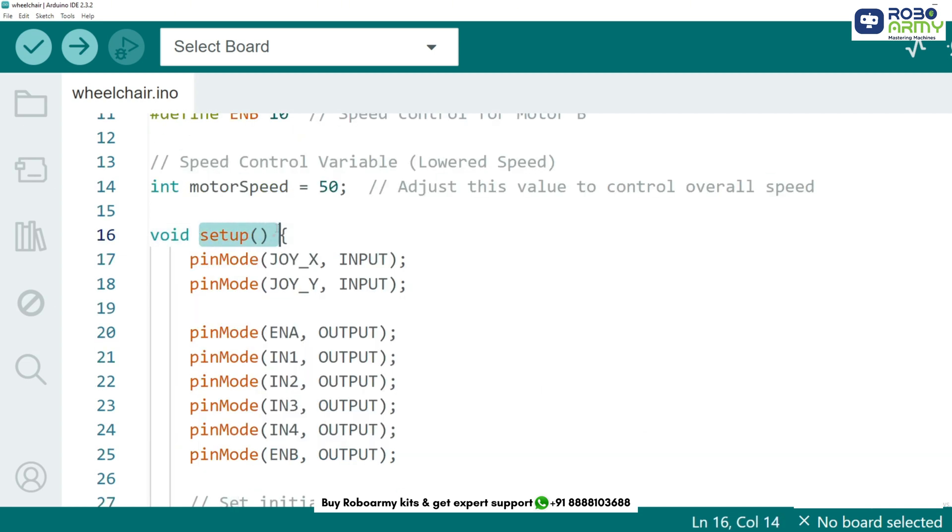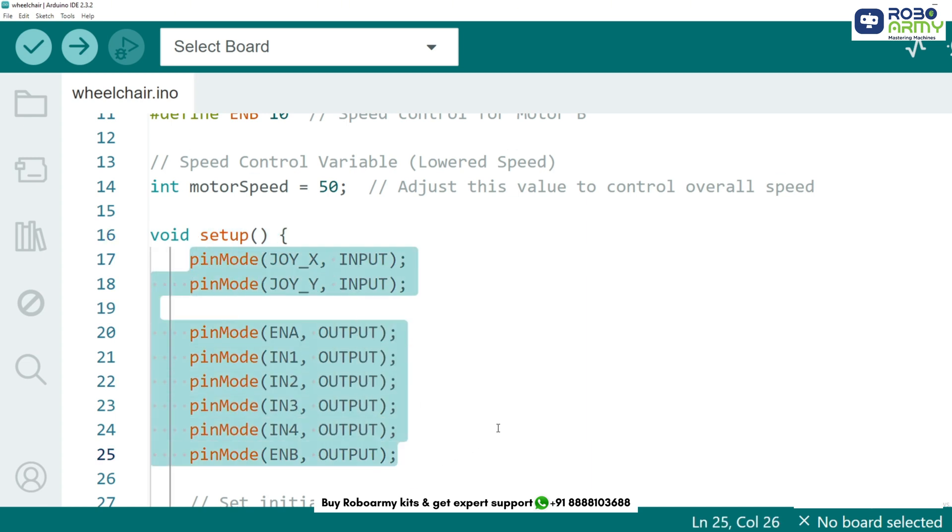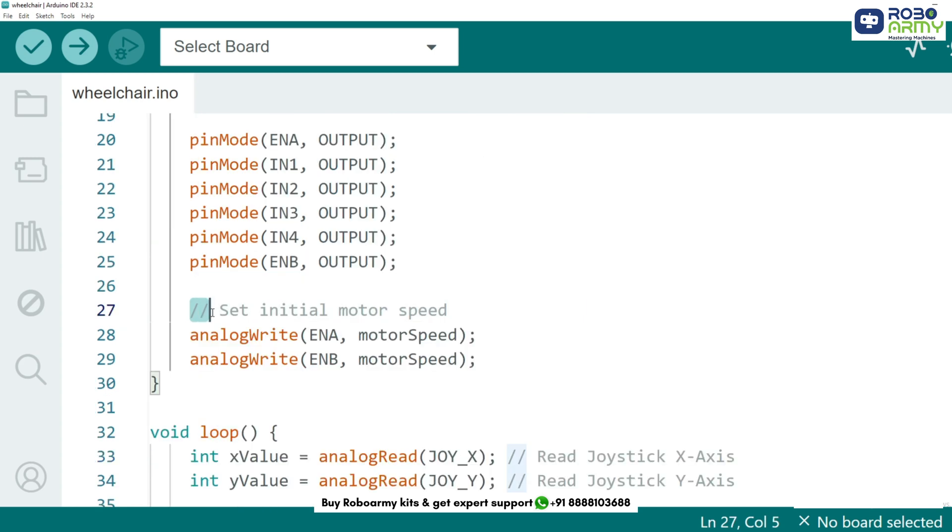Next in the setup function, we define the pin modes for the motor driver and set the initial speed. We set joystick pins as input and motor driver pins as output. Then we set the motor speed using analog write. Change speed as per requirement.